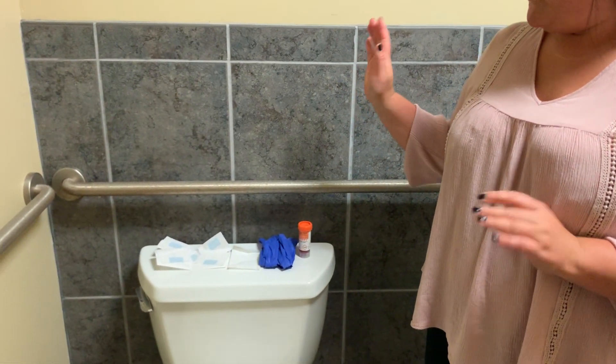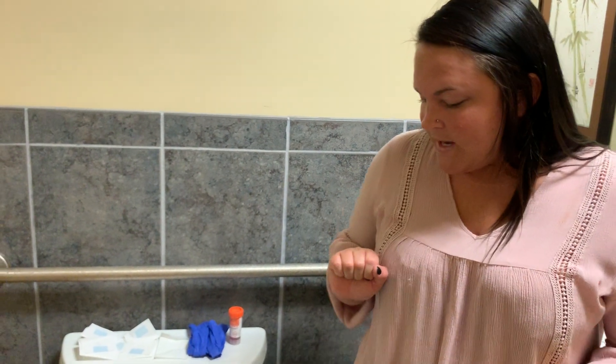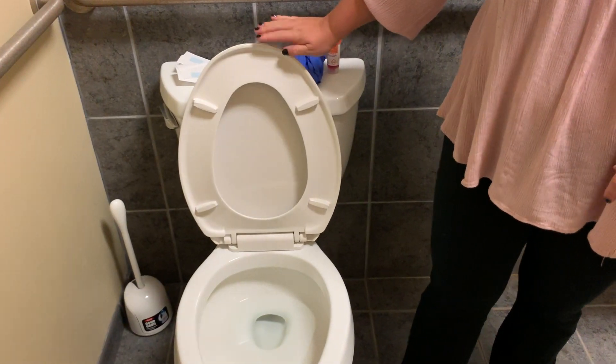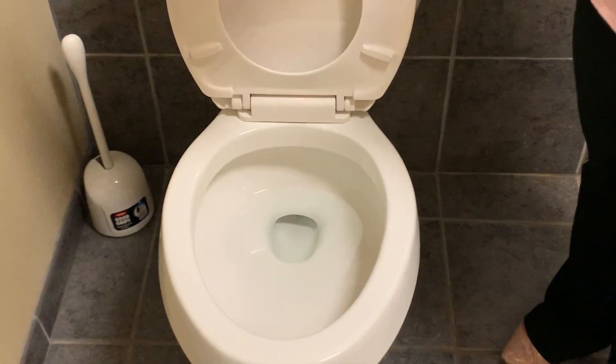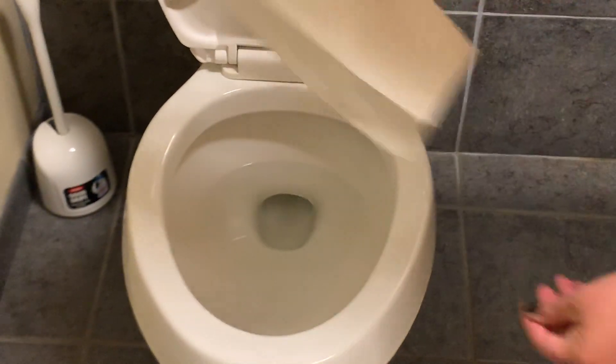A couple of things to keep in mind before you start the test: don't put on the gloves quite yet. If you have to urinate, you want to do that before. Then lift up both the toilet cover and the toilet seat — make sure those are both up — and give it a good wipe down. Try not to use any chemicals, any Clorox wipes, or any bathroom cleaners because it might contaminate the sample. Just use a clean paper towel, wipe down the bowl, and throw that away.